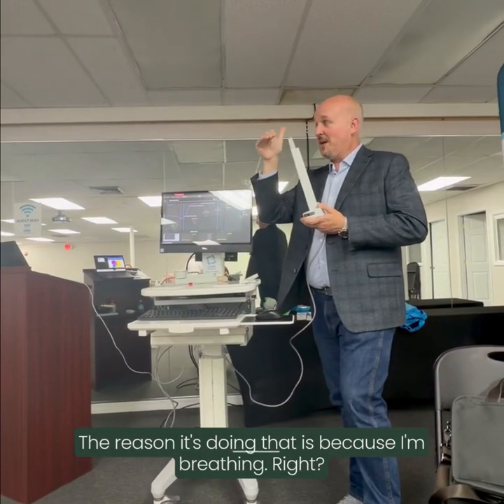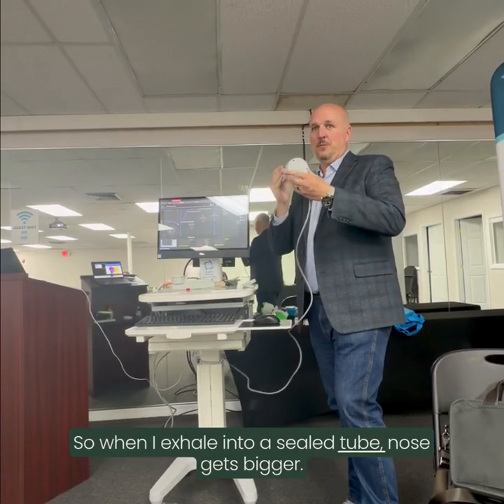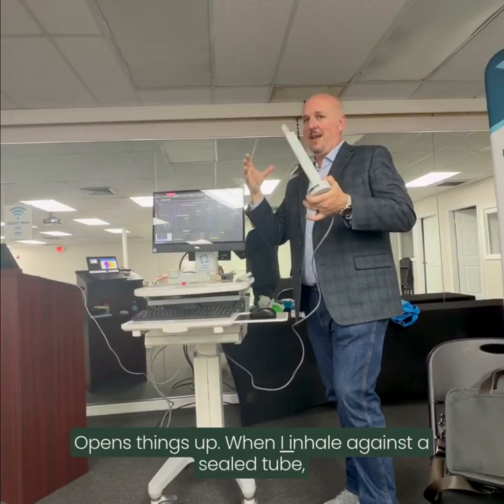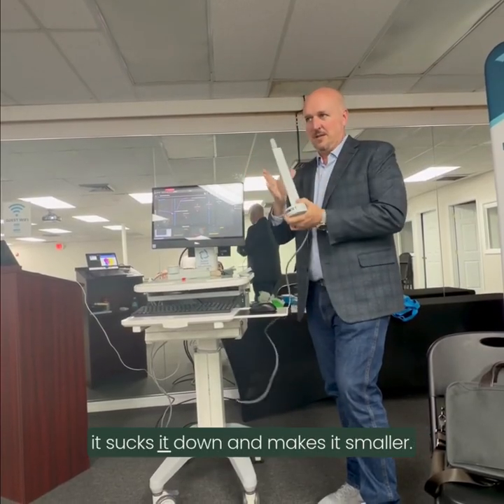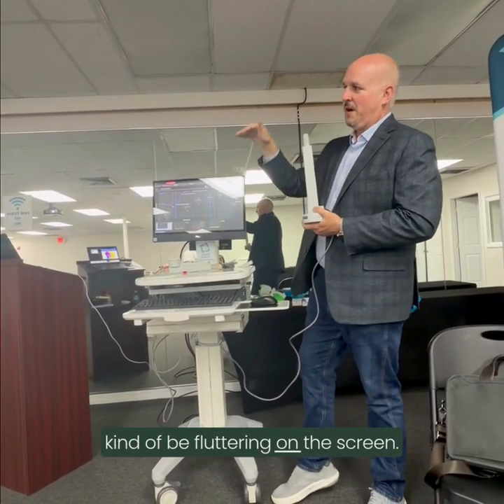And the reason it's doing that is because I'm breathing, right? So when I exhale into a sealed tube, the nose gets bigger. It creates pressure and opens things up. When I inhale against a sealed tube, it sucks it down and makes it smaller. So what you'll see is the line will be fluttering on the screen.